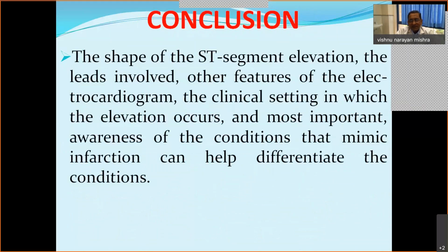The shape of the ST segment elevation, the leads involved, other features of the electrocardiogram, the clinical setting in which the elevation occurs, and most importantly, the awareness of conditions that mimic infarction can help differentiate.